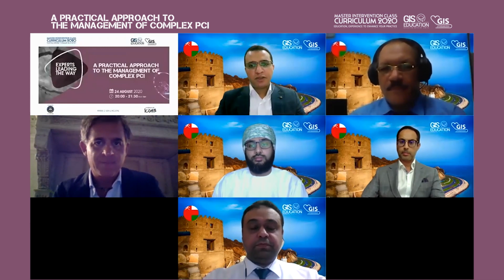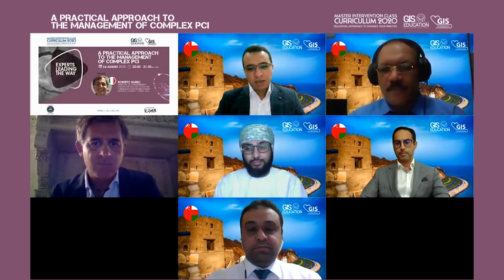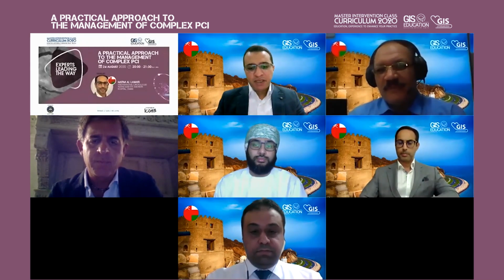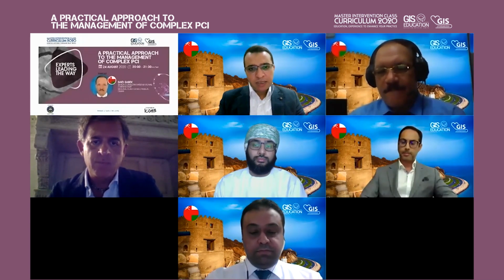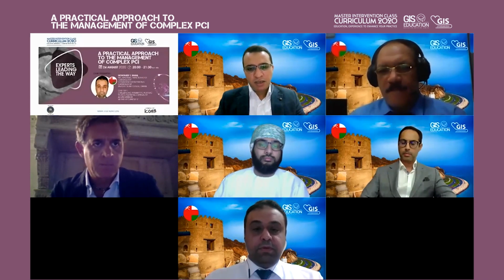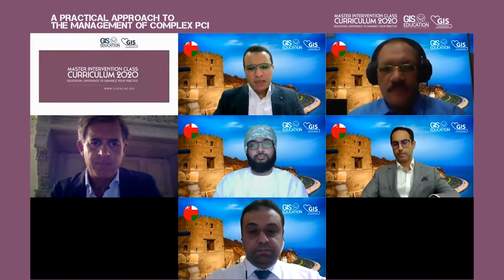Okay. Another question to Dr. Garbo. Regarding the nano crush or nano DK crush, have you any experience with the nano DK crush? The nano, what do you mean with the nano? There are some proposed techniques regarding the nano DK crush, where the protrusion of the stent is very minimal, not the 3 millimeters in the main vessel. It is proposed by some Indian group, and then tested again by some British group, published, I think, in 2019.